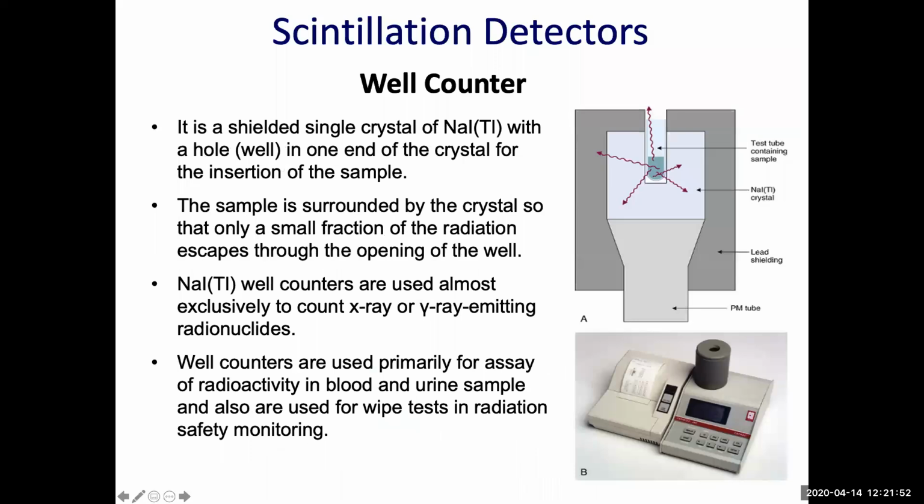The second application is the well counter. It is a shielded single crystal of sodium iodide with a well or hole in one end of the crystal for the insertion of the sample. So all this is the crystal, and inside, we have a hole or well to put the sample and read the activity or the number of counts of this sample.